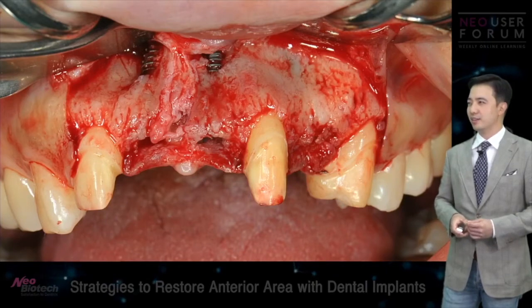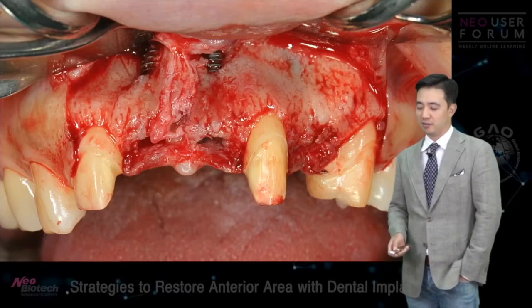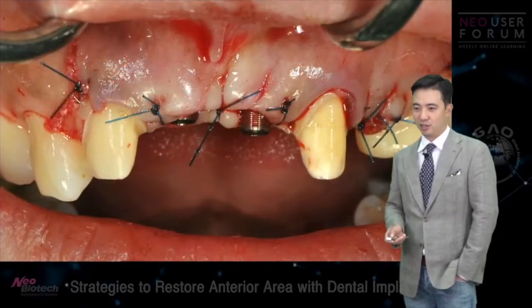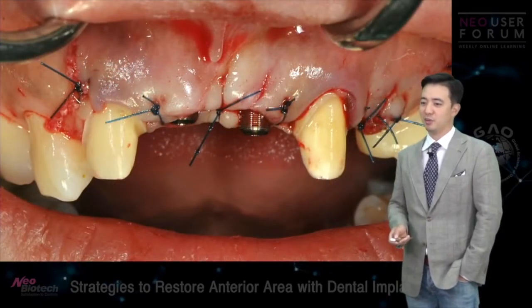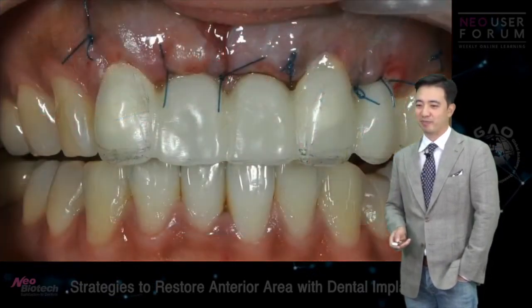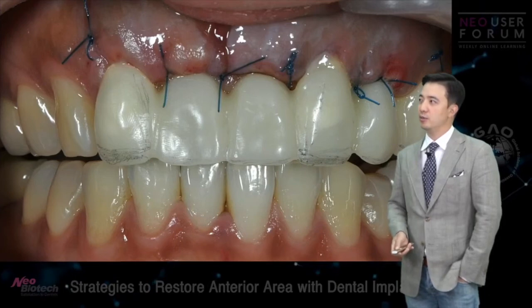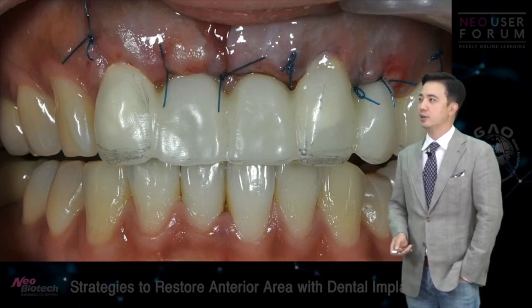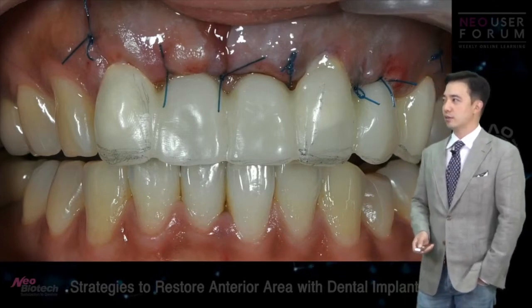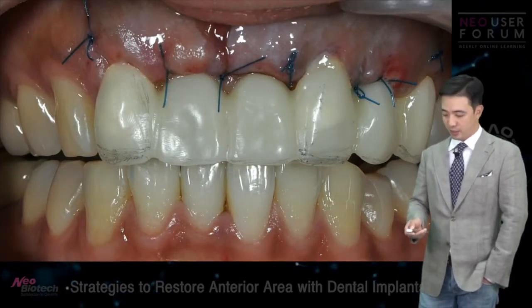I was so brave, I think, that I just went in. Okay, I'm just going to GBR the heck out of it, and then I added a lot of bone, sutured, and I thought, oh, I'm the best surgeon in the field. But I didn't really know, or I think I knew, but I was too optimistic to do this kind of brave surgery, because you'll see what's going to happen next time.